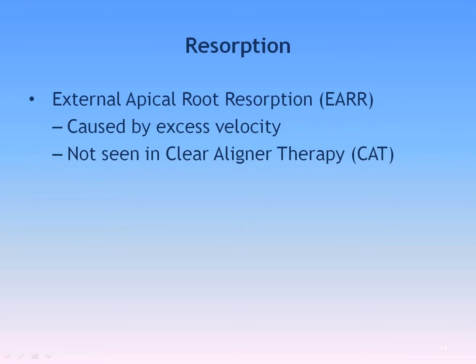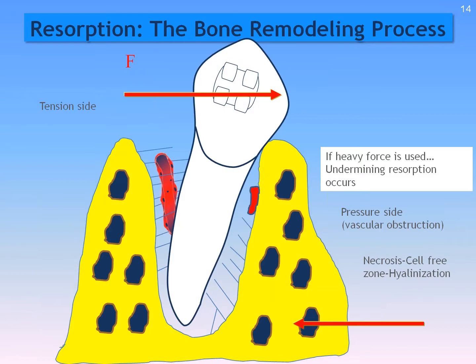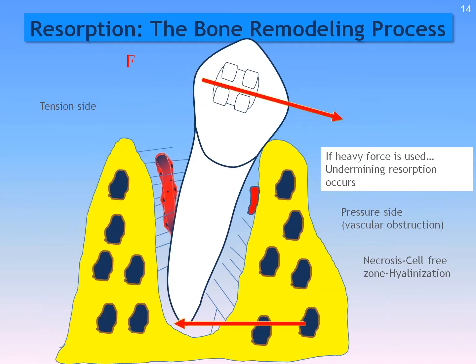In I think over 3 million cases now with Invisalign, we've yet to see a single recorded case of external apical root resorption. That external apical root resorption occurs particularly with brackets or fixed ortho via that same idea that we talked about. You put force on a tooth and that force goes through a bracket. But if you put too much of it, what really starts to occur is the tooth does this, it tips over. And when it tips over sideways, now the force is directed in a different direction. You actually have a force going like that, which drives that root now into the bone.